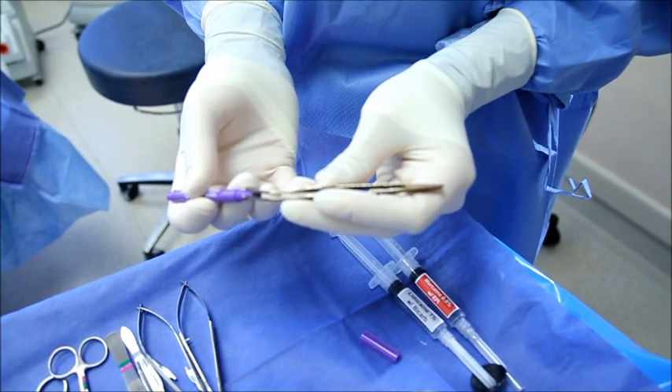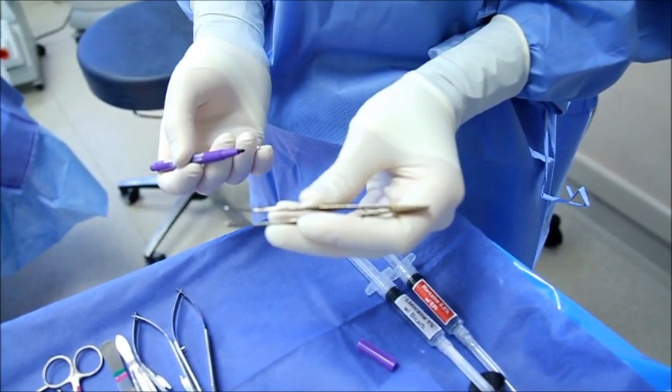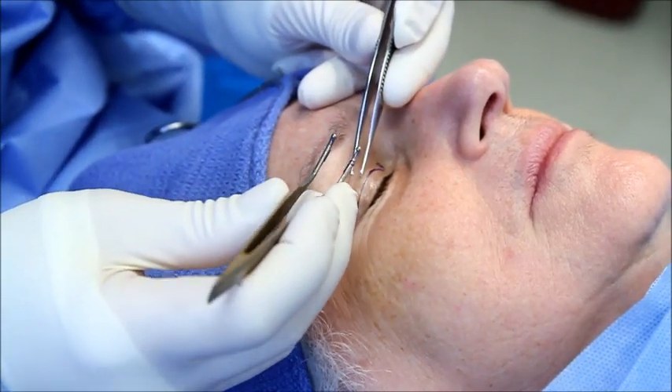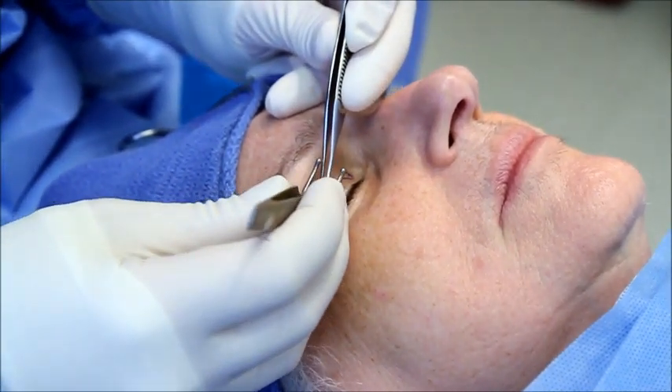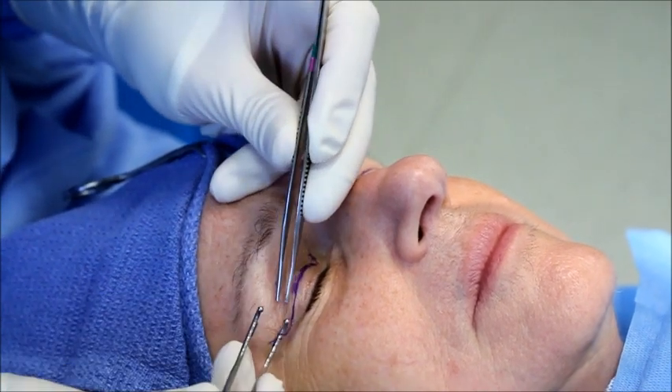So we're transferring the ink to the platforms on the marking forceps. I'm going to pinch your skin here again. You can see the transfer of that mark.